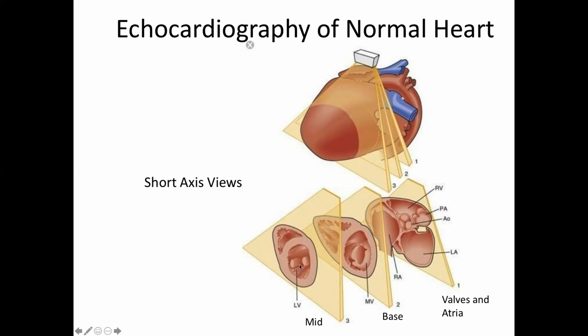This usually happens in a very concentric and synchronous way, right? So when you're watching it, it's just like a donut where the hole in the donut gets smaller and then bigger and then smaller and then bigger. And it happens equally around each angle. When that doesn't happen equally, when one of those angles looks weird because the heart wall is not getting thicker, it's a hallmark sign of the myocardium not performing well.